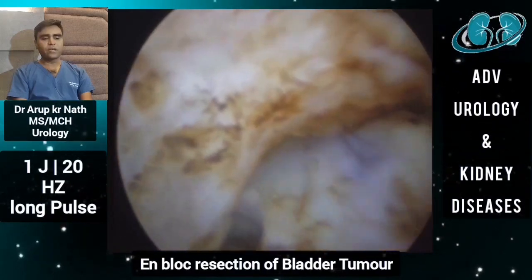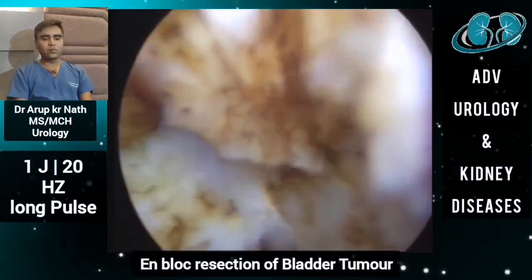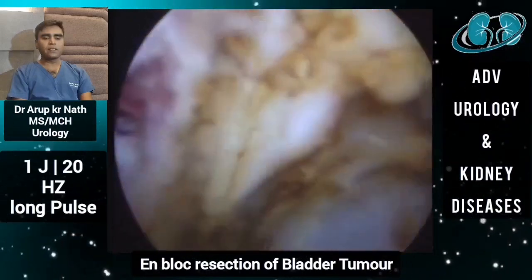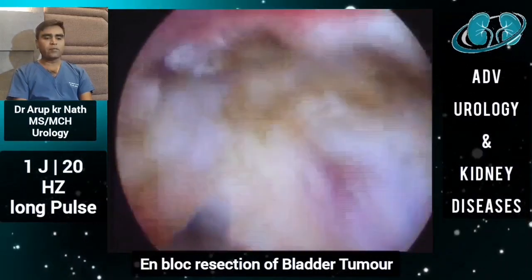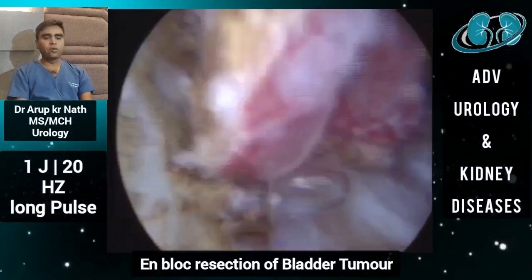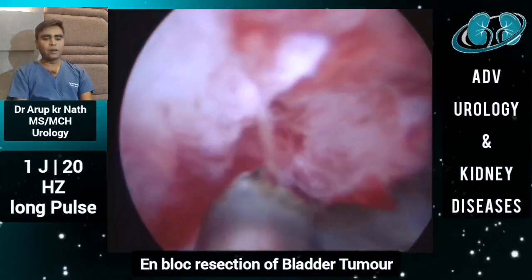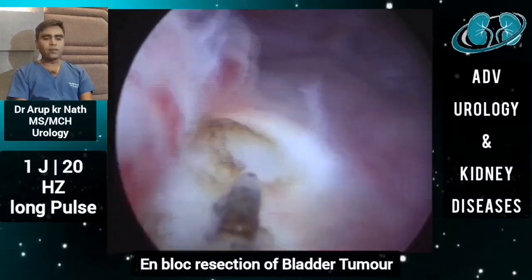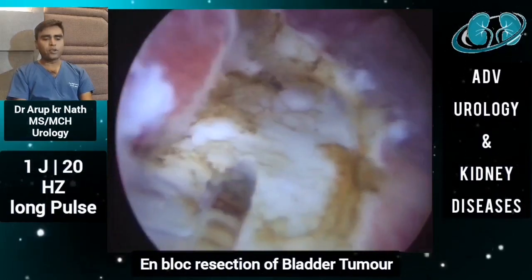You can see we are resecting the tumor out from the tumor bed by mechanically elevating it, gradually progressing superiorly. As it is a big tumor, we could not mark the margin on the superior side initially, so we started enucleating the tumor from the lateral and distal sides. You can see it is coming so beautifully out from the detrusor muscle — the muscle fibers are well visible, representing the deep limit of the resection. As we progress proximally, we can see the margin and start marking the superior lateral side as well.